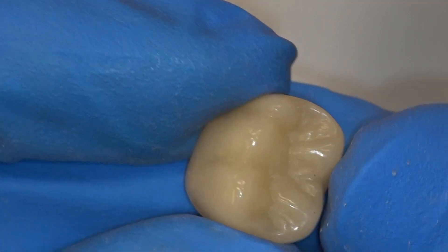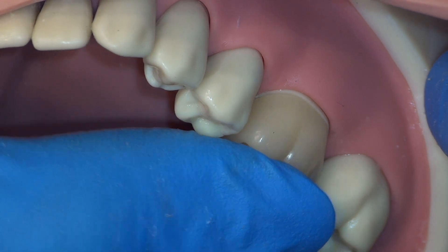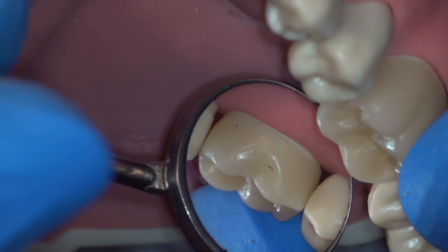We inspect our temporary for any rough areas that need final refinement and seat the temporary. Inspect the temporary circumferentially to ensure no new problems have developed.